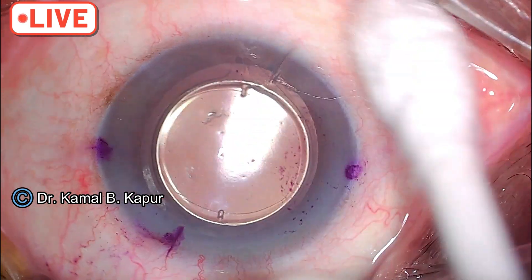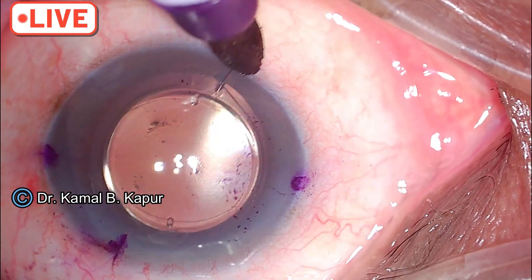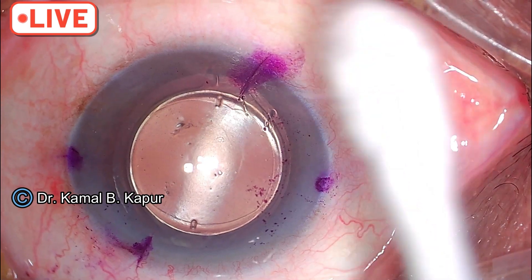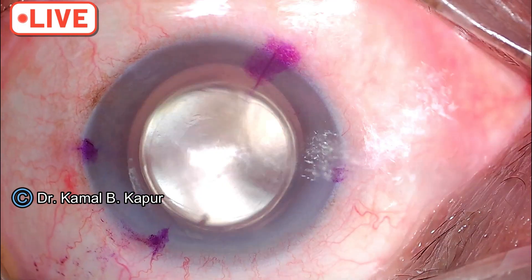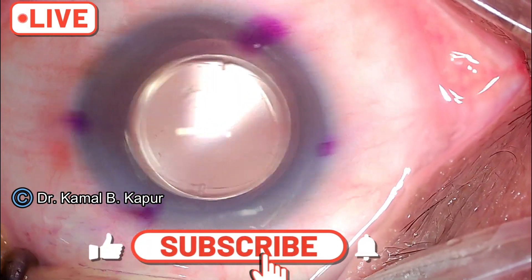The same thing is repeated here. This gives me an approximate range of dialing. The lens needs to be rotated by approximately 15 degrees or so.